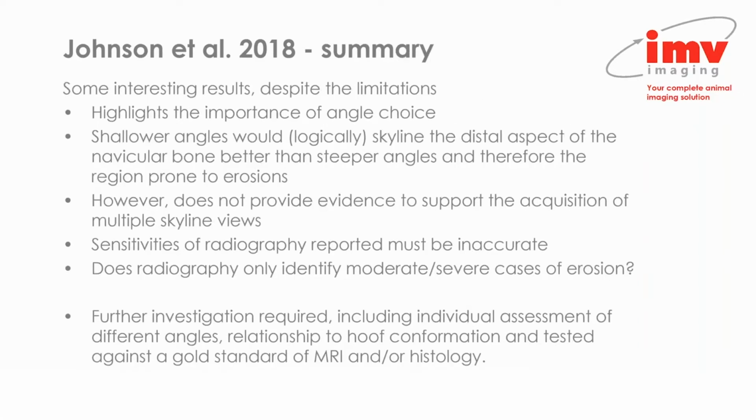So despite the limitations, there are some potentially interesting results that I think are worth discussing. I think it potentially highlights the importance of angle choice. Shallower angles logically skyline the distal aspect of the navicular bone better. And so if we are suspicious of an erosive lesion or want to evaluate the distal aspect of the palmar compact bone, acquiring a shallow angle may well be of some clinical use.